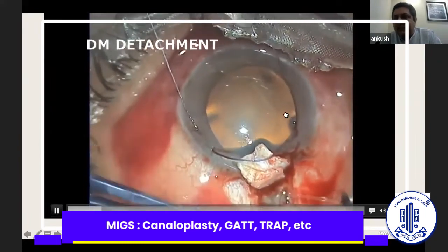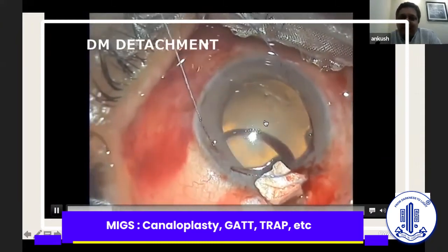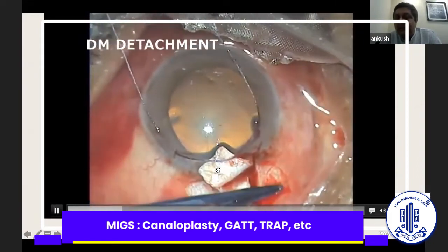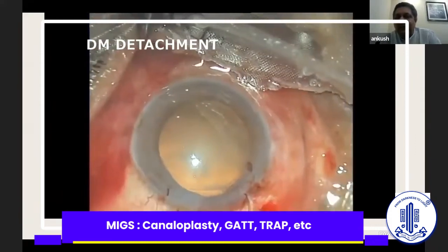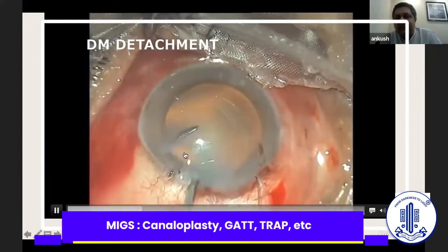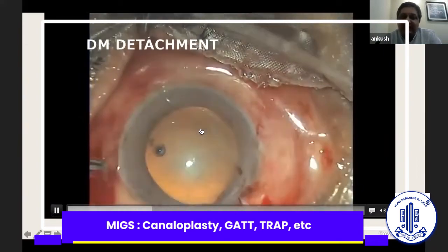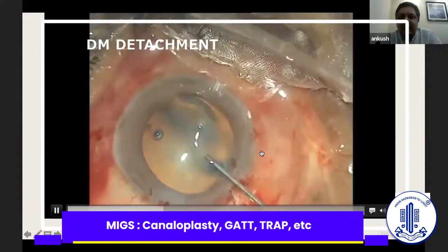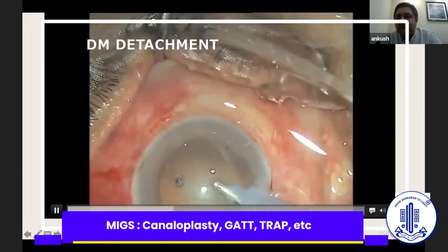The catheter was passing anterior to the Descemet's membrane rather than below it. I had a suspicion something went wrong, but I didn't realize it was coming anterior to the DM and just pulled it through. I compounded the problem by making a side port in the cornea — wishful thinking that the DM was not detached. I injected viscoelastic, and as I injected, you can see it going anterior to the Descemet's membrane. I then tried to check with saline on a 2cc syringe — nothing was coming out; it was all anterior to the DM. Using the I/A cannula, you can see these folds — the DM is detached throughout now.